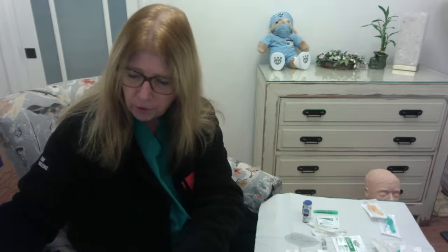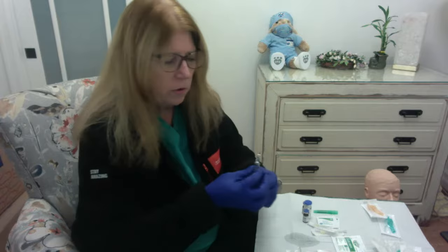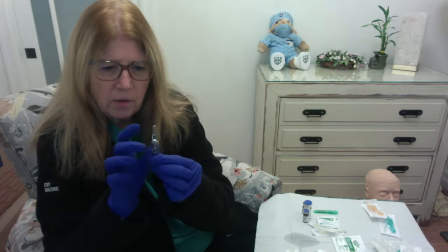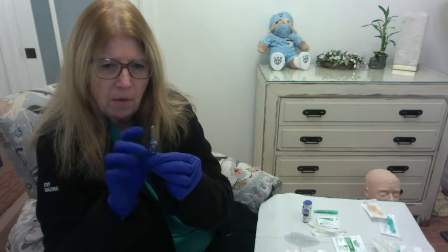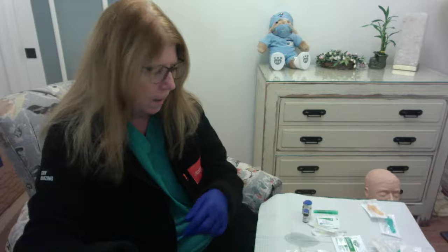Now, let me just tell you that I can tell you most definitely that I have never seen one of these ampule breakers in clinical practice, right? So how then are we going to open an ampule? So we're going to do it safely using a piece of gauze. I'm going to get that liquid to get down into the bottom of my ampule so that once again it is full on the bottom.